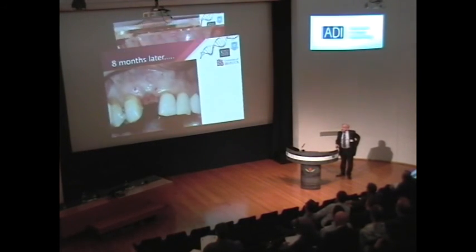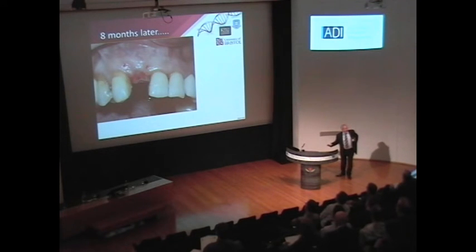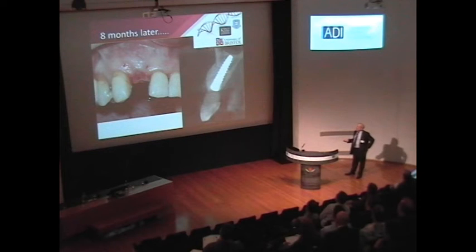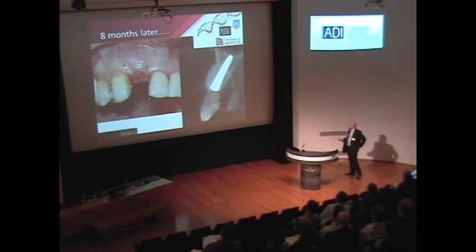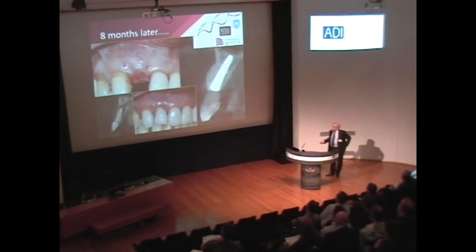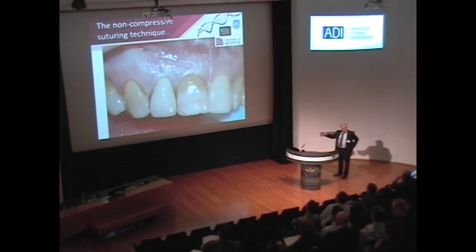Now, the reason this is in here is that the work is still ongoing. This is at 8 months when I am exposing that implant. It's put in there as a picture to show what is actually underneath. Alright? Well, you've got an extremely large amount of bone in the process of regeneration. Implant is being exposed. That's where we came from. It's a magnificent result. Alright? That's where you came from. Nothing.